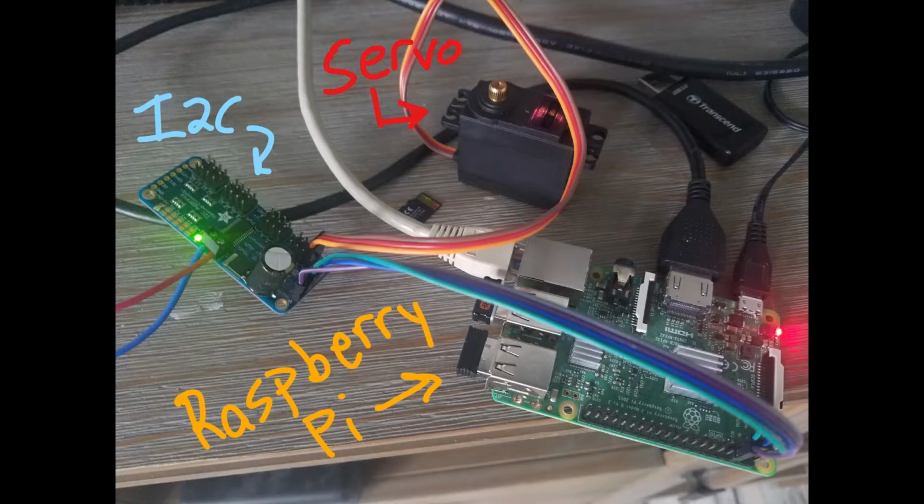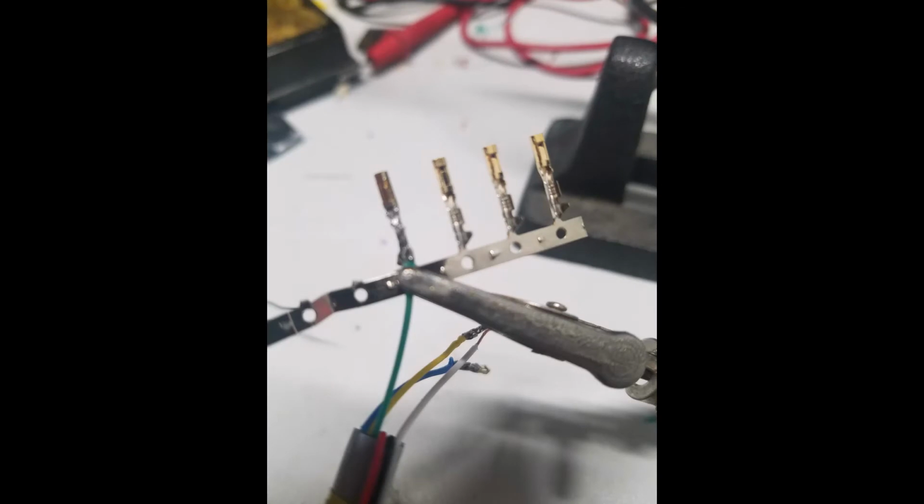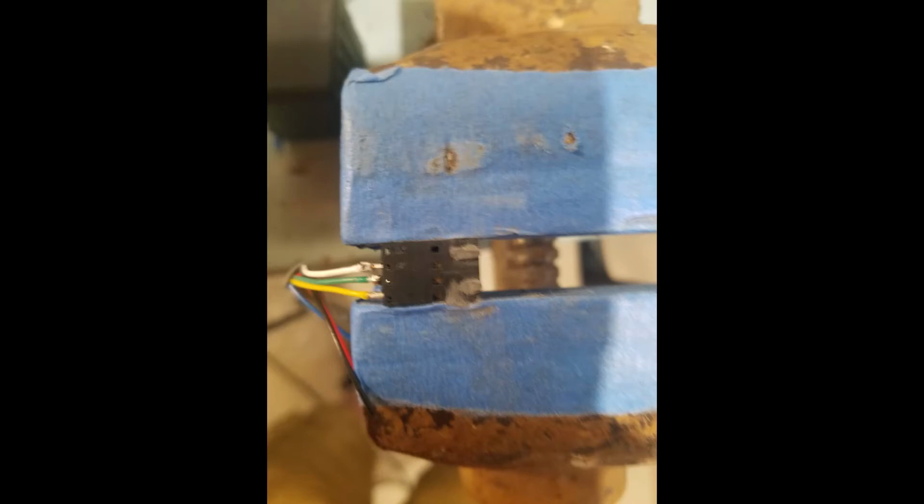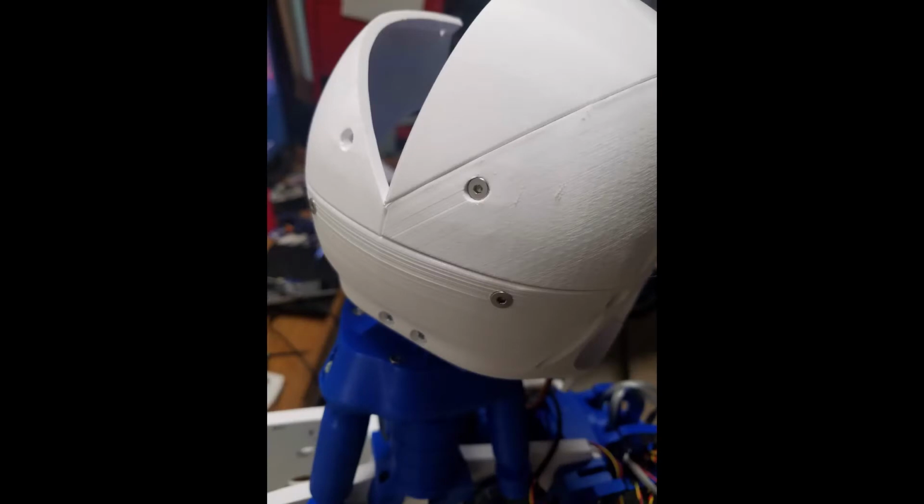This is when I learned the importance of fuses and proper wiring. I ended up shorting out the Raspberry Pi, causing it to no longer be functional. I also blew a fuse. A fuse is a little piece of plastic and metal that will blow when you short circuit. If you don't use fuses, I've had it happen before where it will start smoking and actually melt the wires together. It was after this that I discovered that My Robot Lab does not work with a Raspberry Pi.